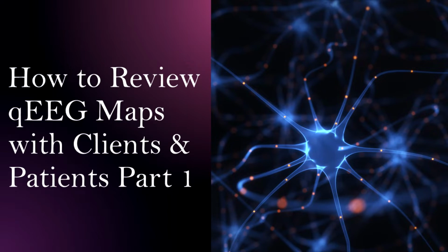Richard and Judy and I will start off with just sharing a little bit of information. Maybe it might be smart to have Richard go over how they designed the whole mapping system and why you have all these things. And then we're all going to take turns sharing how we talk to clients. For those of you interested in this topic, it's going to be very helpful to ask questions and not just wait and hope that somebody will hit the topic you want us to talk about. So hopefully that'll happen.